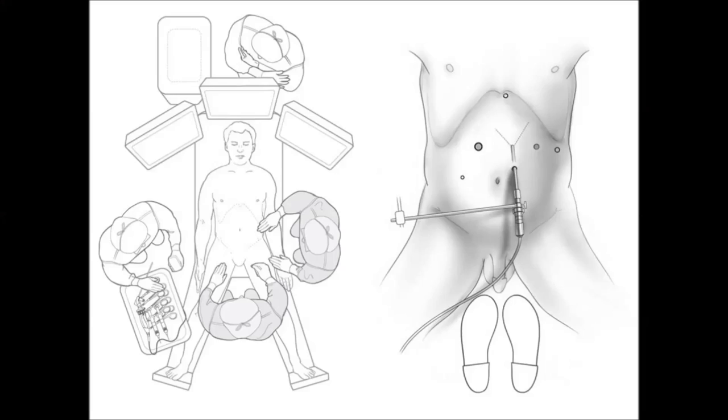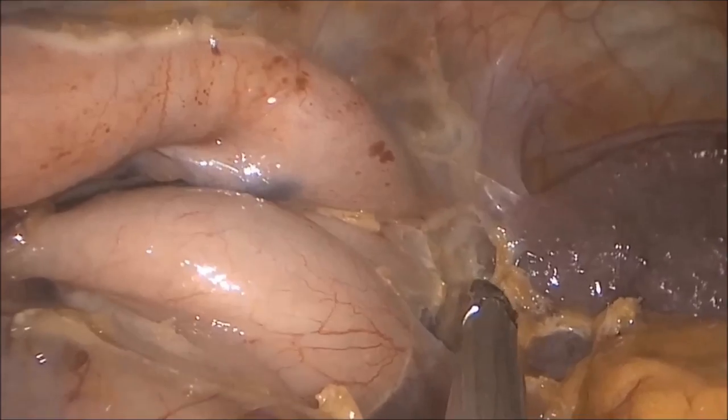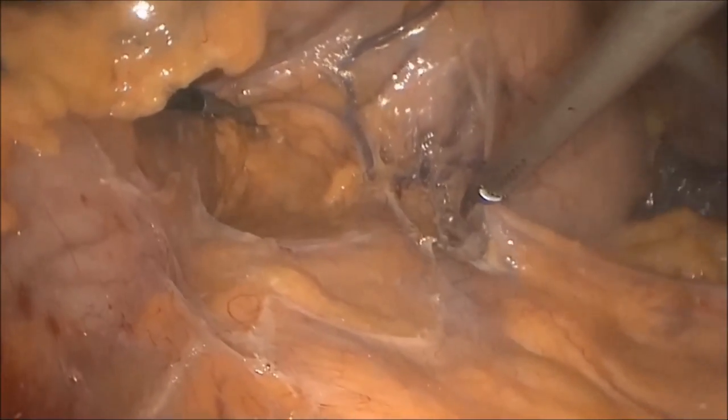The patient is then placed in a split-leg supine position and a left-sided chest tube is inserted before the neck, chest, and abdomen are prepped and draped. The short gastrics are divided, and mobilization is then carried along the greater curvature using a harmonic scalpel.